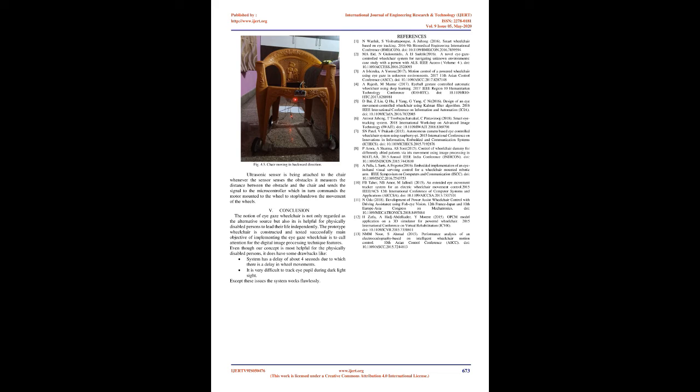Distance is being calculated according to the movement of eye pupil, where the minimum distance represents eye pupil move to left position and the maximum distance represents eye pupil move to right direction. When there is no movement of eye, it is in middle position. When the movement of eye is in left, the left motor which is mounted to wheels of wheelchair runs, and vice versa. Wheelchair is stopped when the eye is closed for about 3 seconds.